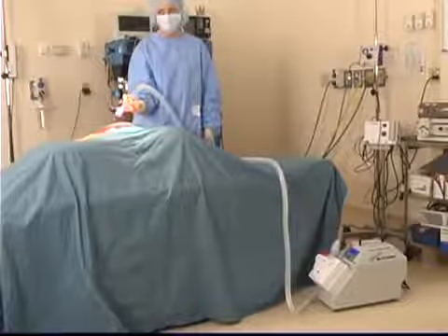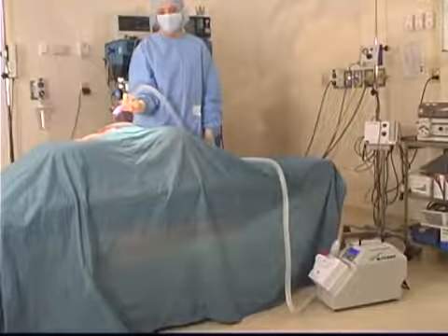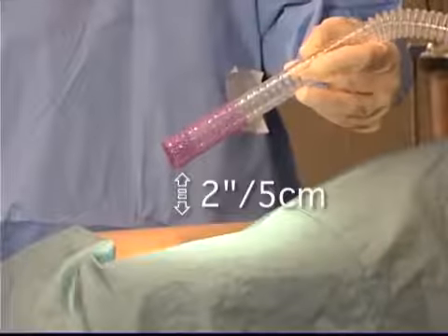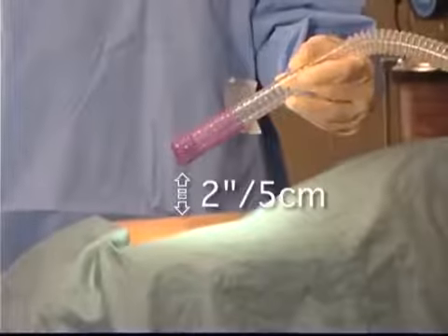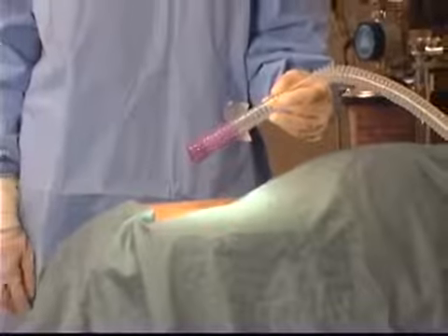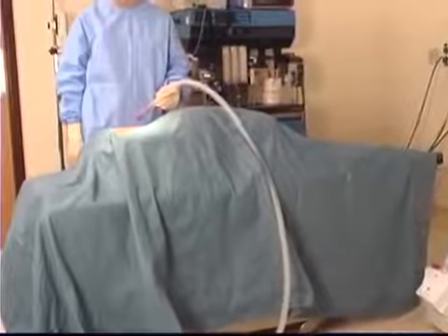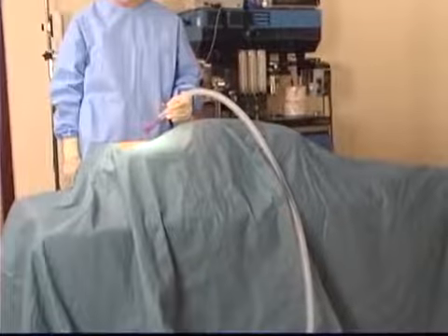The tube may be held by a member of the surgical team at the point of smoke creation. The CDC recommends that the tube be held as close to 2 inches or 5 centimeters from the point of smoke creation as possible. This will maximize the smoke capture and ensure that the smoke plume does not reach the breathing zone of the OR staff. The standard 7/8 inch or 22 millimeter tubing can be ordered in sterile and non-sterile configuration, with or without positioning wands, and an optional sponge guard.